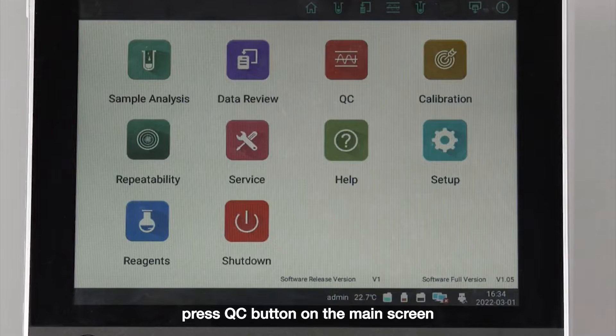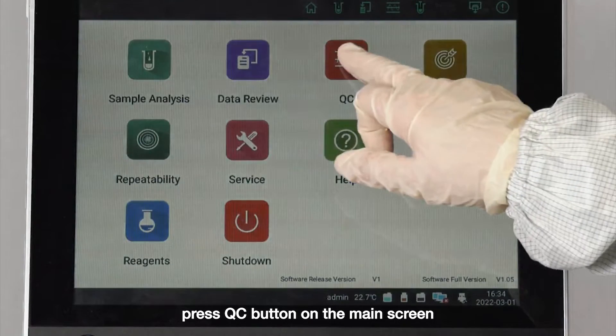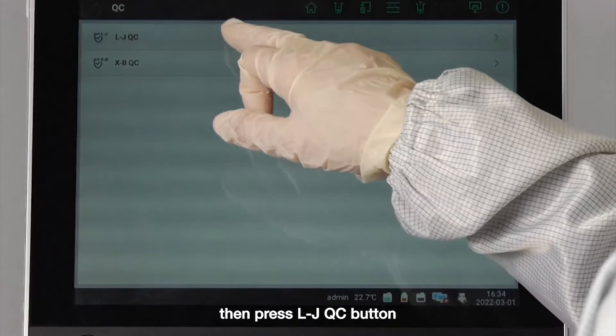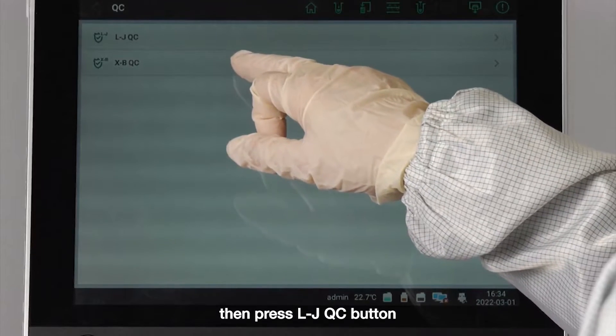Press the Quality Control button on the main screen, then press the LJ Quality Control button.